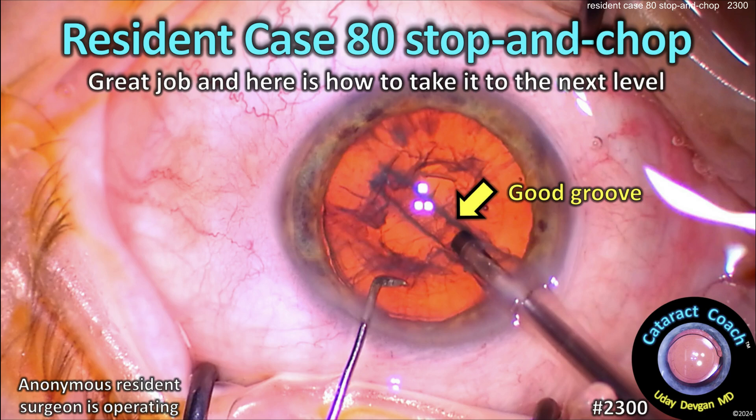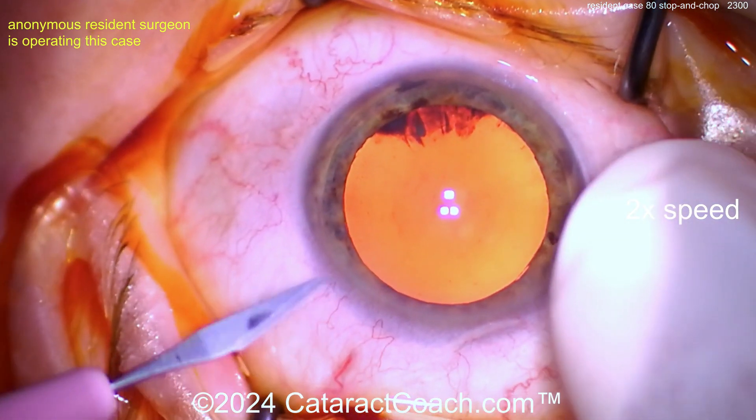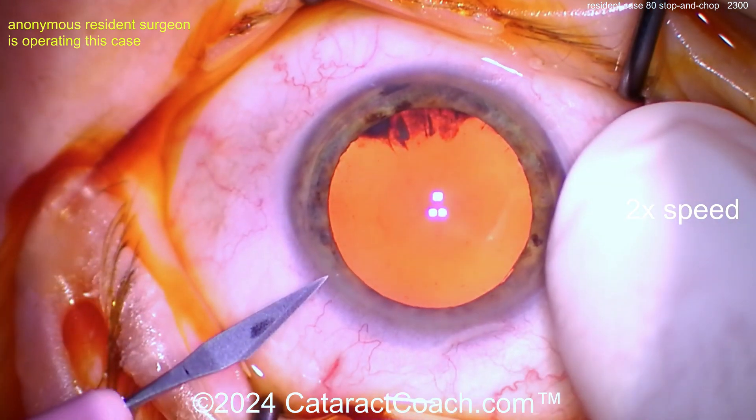CataractCoach.com resident case number 80 — stop and chop. Great job, and here's how to take it to the next level. Let's watch together. First things first: nice, it's in focus, good draping, eye in primary position.